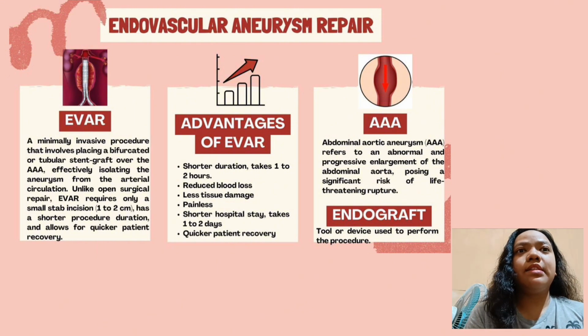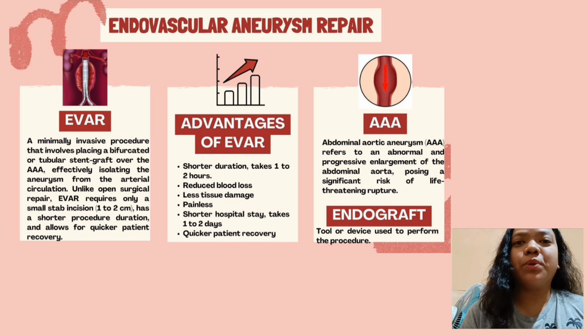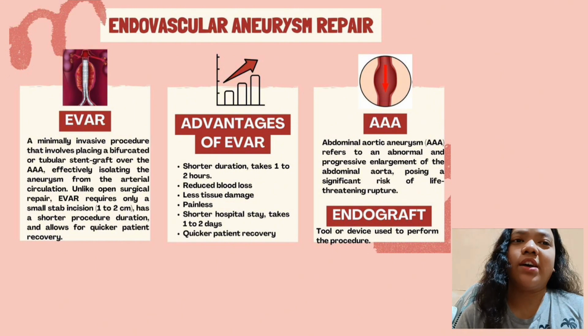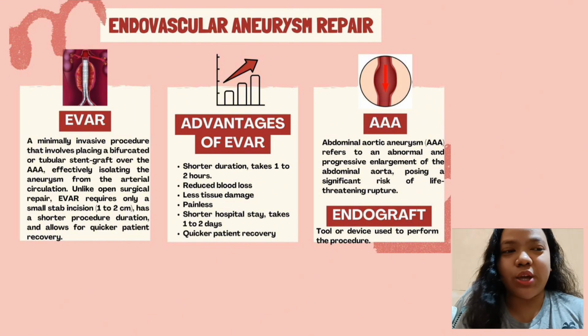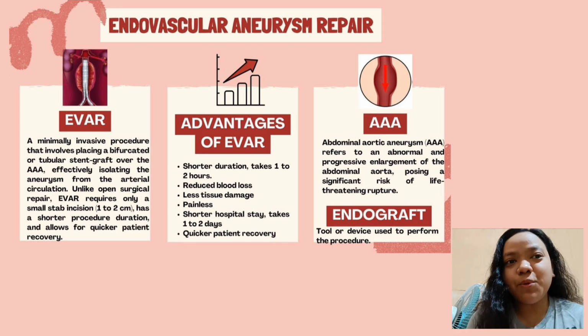And then, the next one is the endograft. It is the tool or device to perform the method. So, para sa mga nalilito diyan, EVAR is the procedure, and then the AAA is the medical condition, and then the endograft is the instrument.